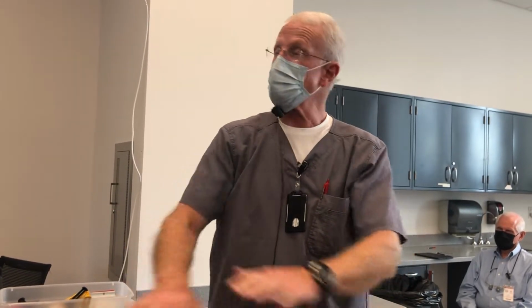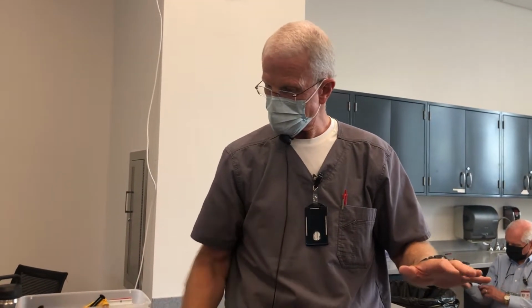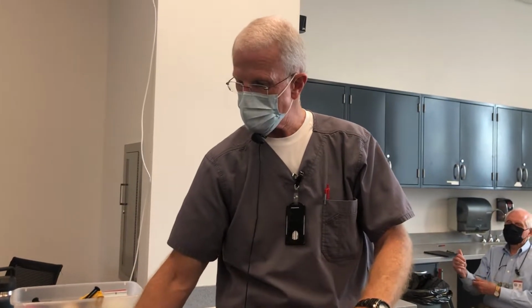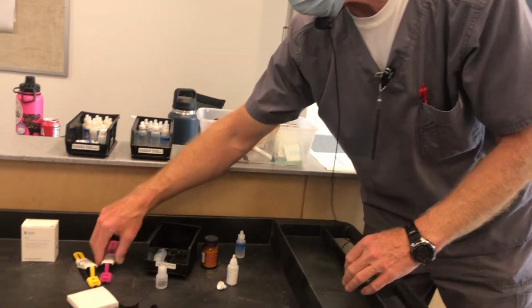Now, if you really have rotten retention with your onlay preparation, you can spot etch, and we'll talk about that more when we do those. In that case, you will get a bond where you've etched to the tooth structure. But you don't want to use a dentin bonding agent. You'll get way too much retention. So that's basically the permanent cements of the old class, and now we get into the resin-based cements.